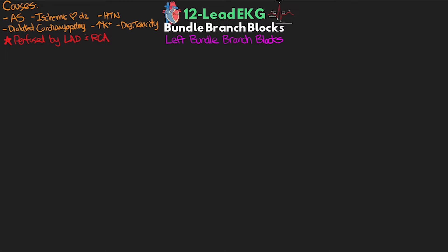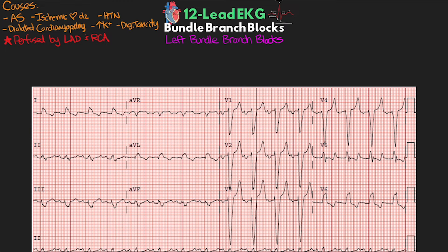In this first left bundle branch block example, it's clear we have a wide QRS greater than 0.12 seconds. Looking at V1, we see a large negative terminal deflection. Using our turn signal method, flipping it down means we're turning left — thus left bundle branch block morphology. We also note a positively shifted J point going opposite of that negative deflection, as well as a positively deflected T wave, both mimicking ST elevation. Looking at V6, we see the opposite — a large positive terminal wave, negative J point shifting, and negative T wave discordance.